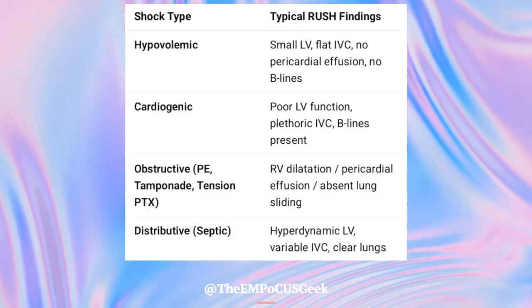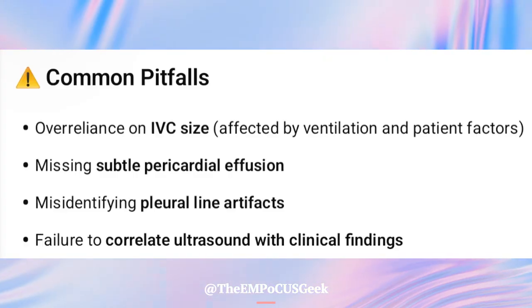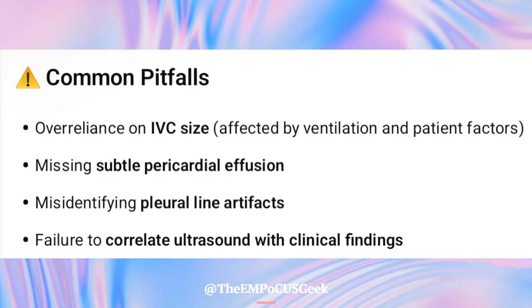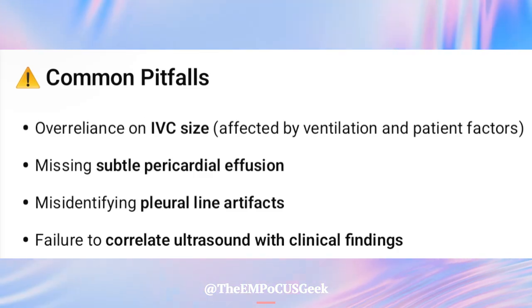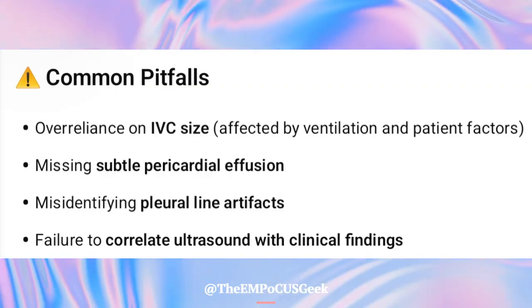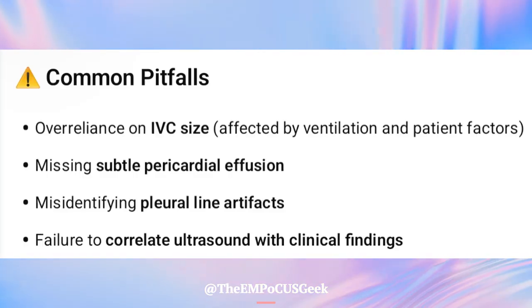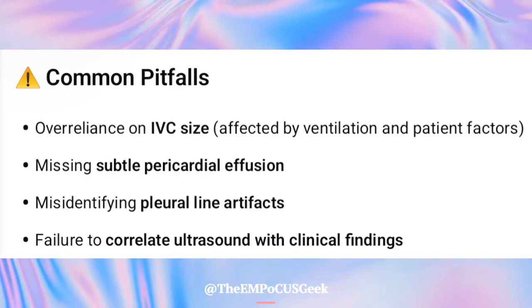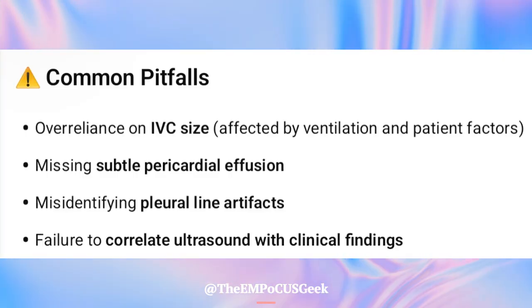For example, septic shock. You must, of course, remember that the RUSH protocol is merely a tool that you could use to diagnose as well as guide your management, and that it does not replace your clinical findings. So, you must always make sure that you relate your ultrasound findings with your clinical findings. The other pitfalls are over reliance on IVC size, which can also be affected by ventilation, missing subtle pericardial effusion, misidentifying pleural line artifacts.